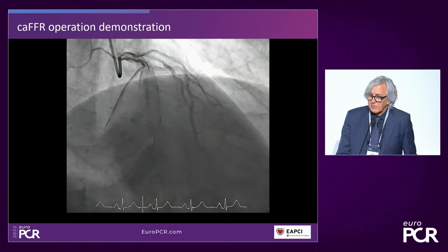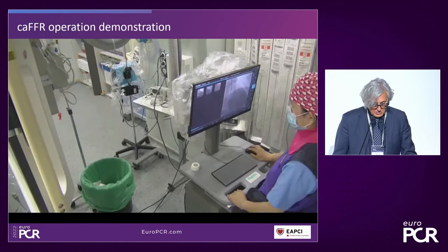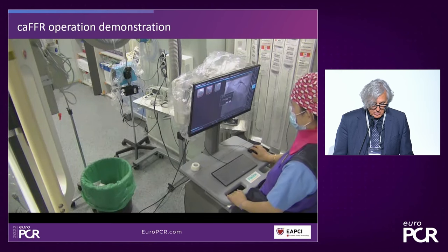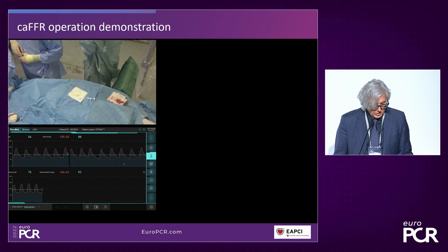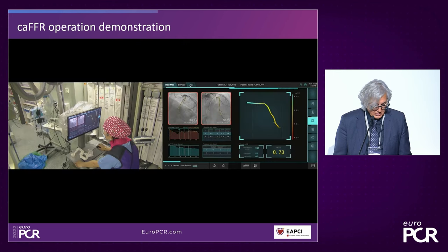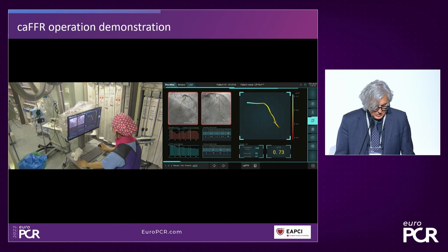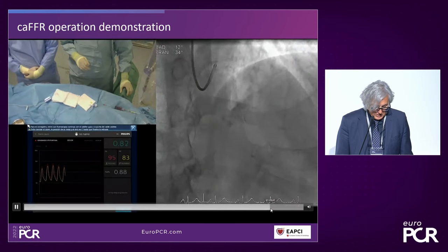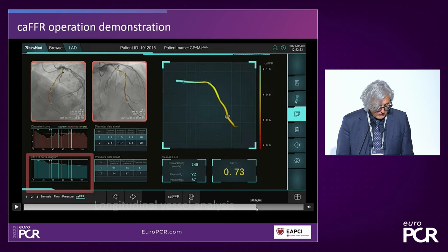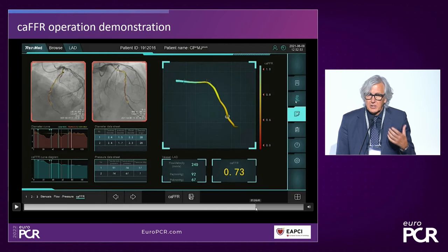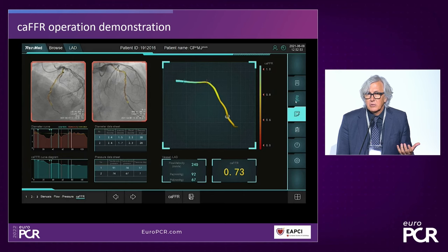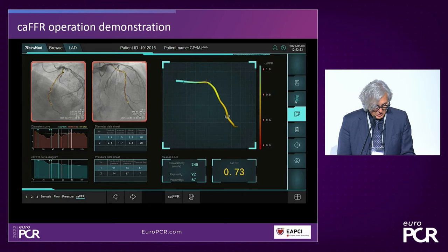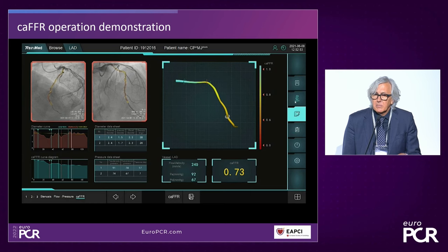Here is a case performed in our cath lab. This LAD vessel shows my fellow Lin Wang obtaining the images combined with the pressure being obtained from the patient. In this particular patient, the CAFFR was 0.73. Now, functional coronary angiography immediately provides co-registration with angiography, because you can locate any position with a given CAFFR value at a certain location within the vessel.